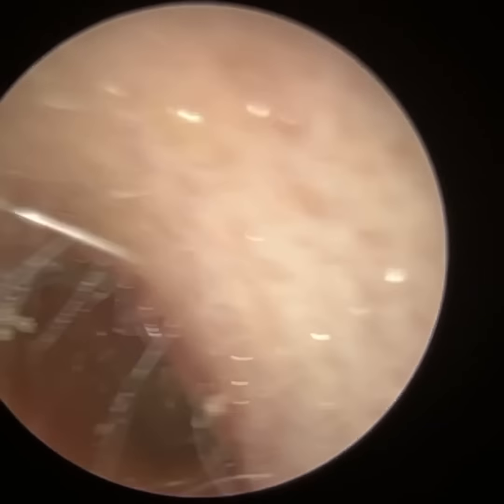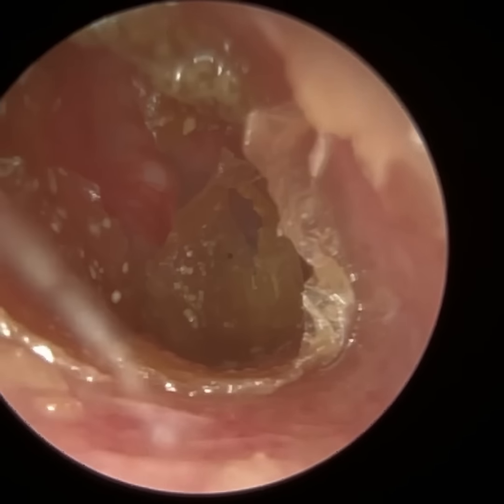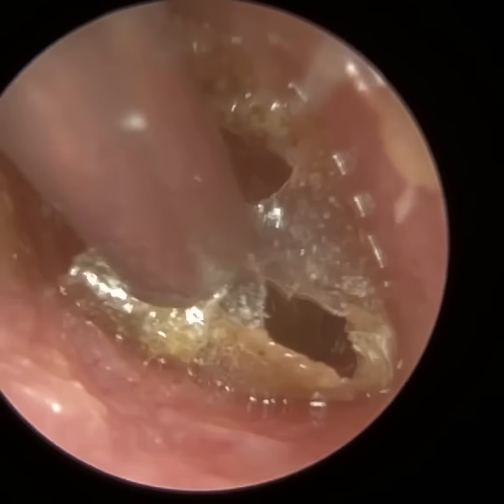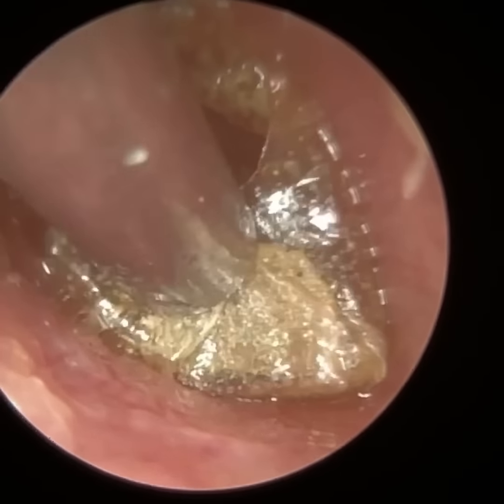Hi everyone, this is Neil Reiteter, consultant audiologist and director of ClearWax. Thank you for joining me in my latest video using the iClearScope Endoscope. This procedure is on a colleague of mine, Matthew Pearson, who's a fellow audiologist and is also known as the Wax Warrior.